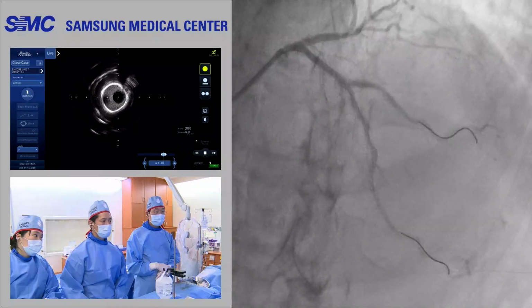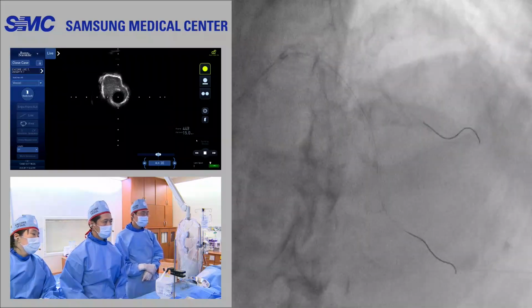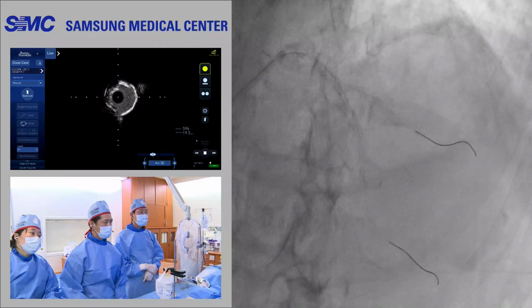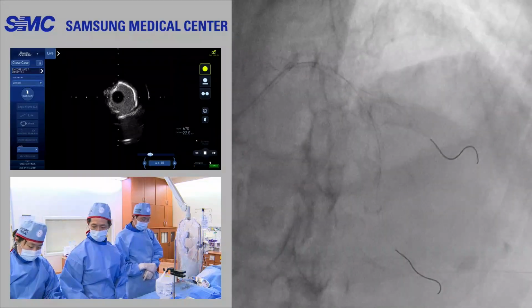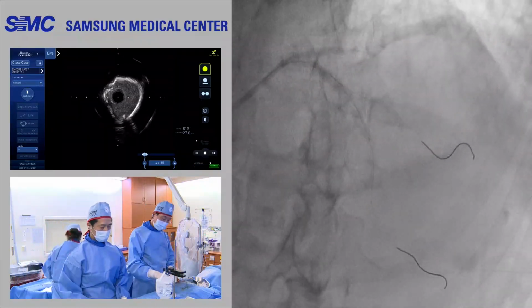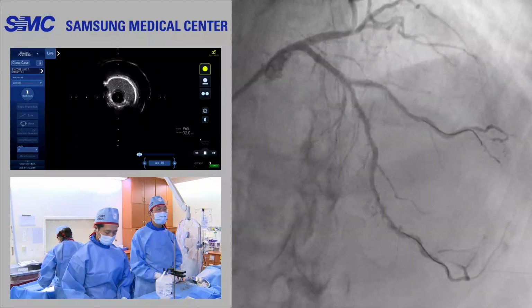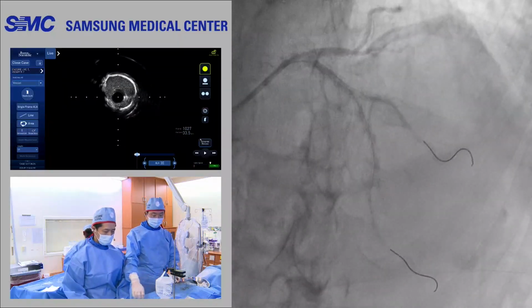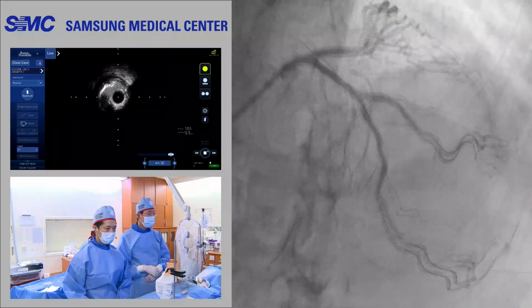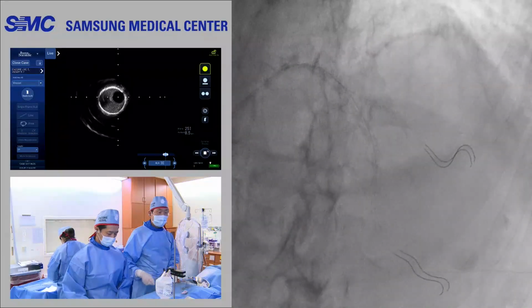You mentioned that the DCB is fantastic and something new, but when does the drug work in this patient, after calcified lesion? With DCB, right now, you did just a simple balloon angioplasty alone. It's a balloon angioplasty. We have experience of almost 30 years. So you mean this is just a balloon angioplasty, not the DCB. DCB is just a touch of the drug. So the drug works maybe 1 month later or later.